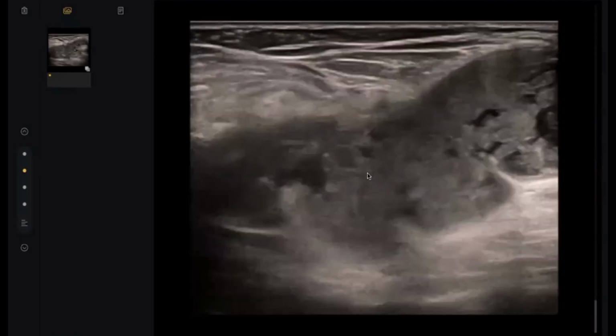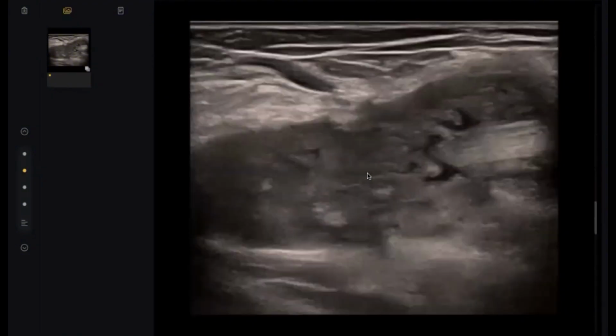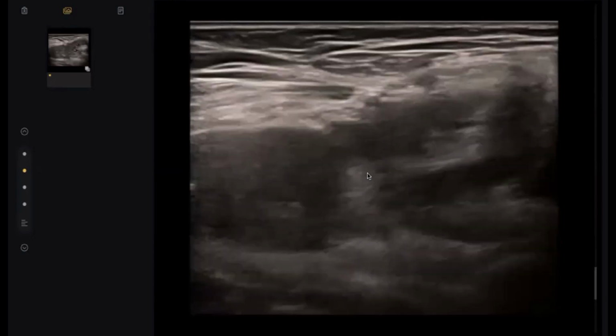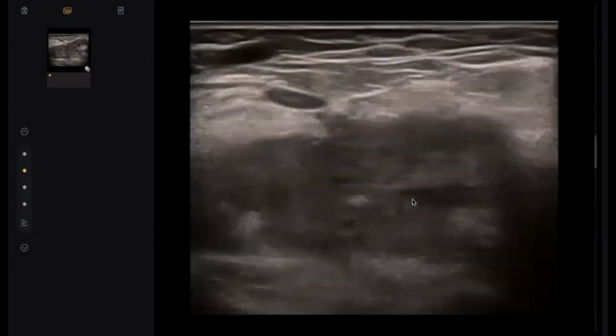So this could be due to a synovium. Excellent. Synovial mass. Give me a differential. So synovial sarcomas. Okay. But look here. Do you think the sarcoma will be enlarged like this without infiltration here? What else? No. So this could be synovial proliferation due to any arthritic involvement, or tuberculous. What else? What is the name of the synovial tumor?